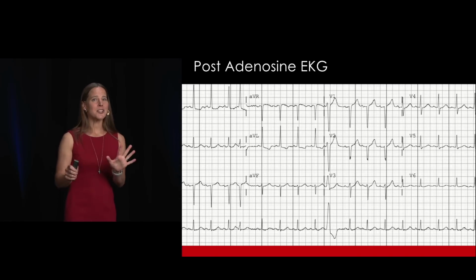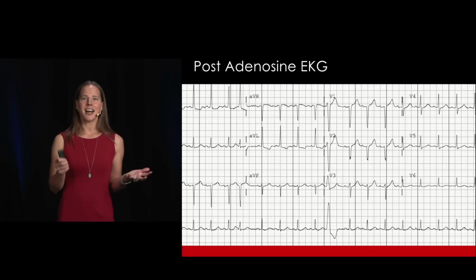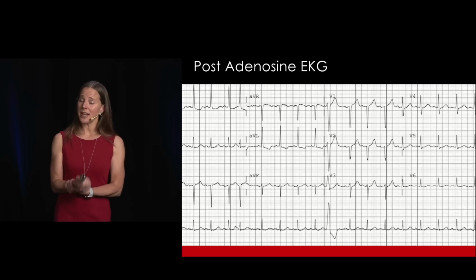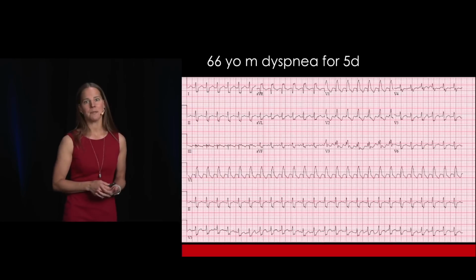So it was really good that we admitted the patient anyways, even though he had SVT, because he got a CABG. So this is another reason to just assume wide complex tachycardias are VTAC and admit the patient to get a workup. Here's another one I saw just a few months ago.